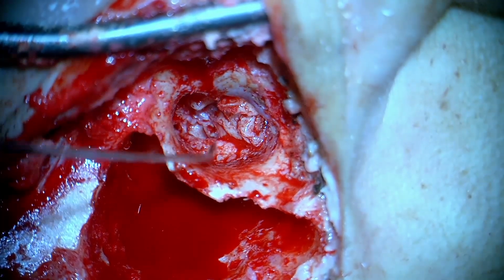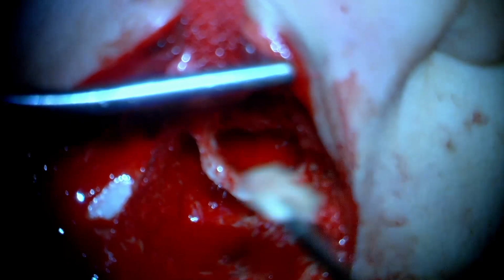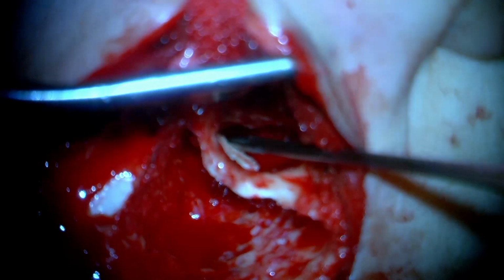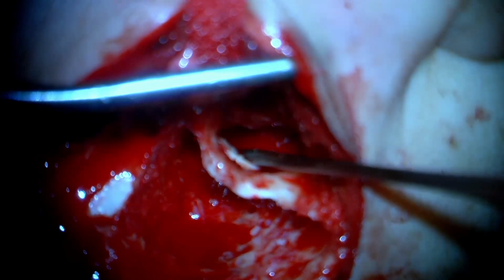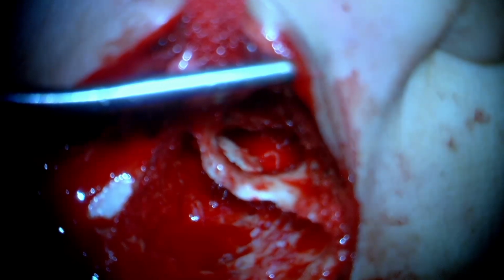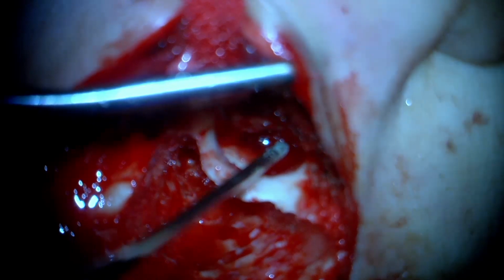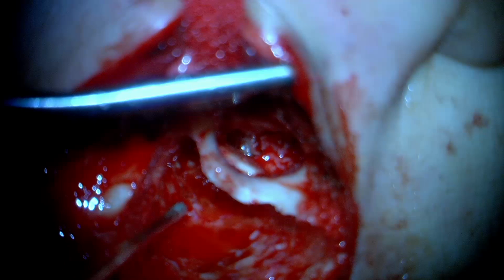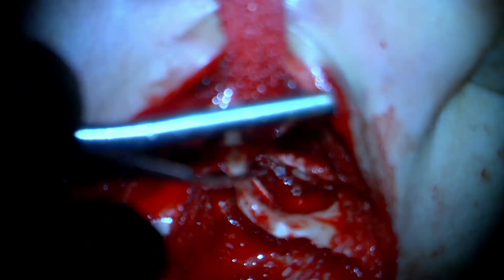So now you see when we put our flap back, post resecting the unhealthy tissue, our TM flap falls back, and now we'll be using a full thickness conchal cartilage to bridge the defect in the external auditory canal posteriorly, and this has been approximately sized in accordance with the defect size. It shouldn't be too small, it shouldn't be too big. It should be optimized, because if it's too small, it's going to just slip inside the mastoid cavity, leaving the large defect, which obviously would not work out and lead to recurrent cholesteatoma.